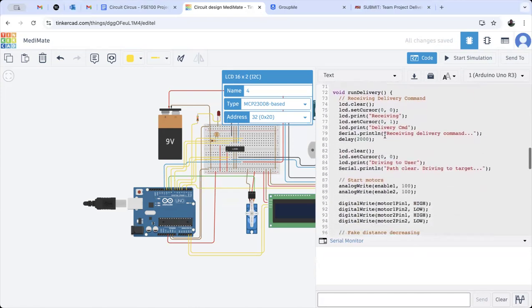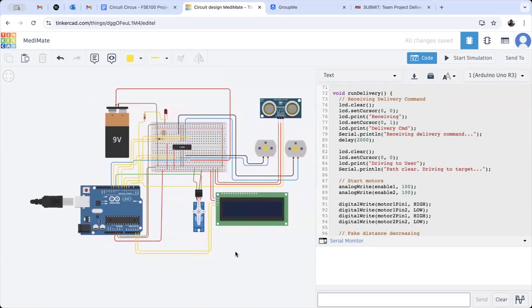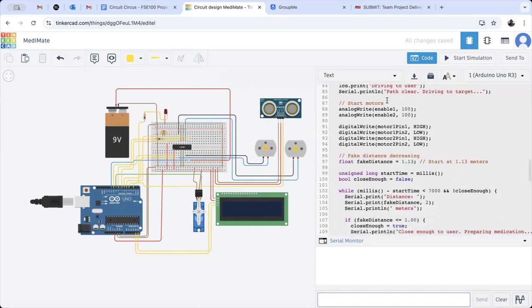And so let's take a look and run the delivery. It's going to print out receiving the delivery command, and then it is going to start printing distances. Since this is a simulation, the distance is a little bit tricky, so I had it just count down, and it's going to continue going down. So right here we just fake the distance. We start at 1.13 meters and it goes all the way down. Once it gets down to 1 meter, it will deliver.